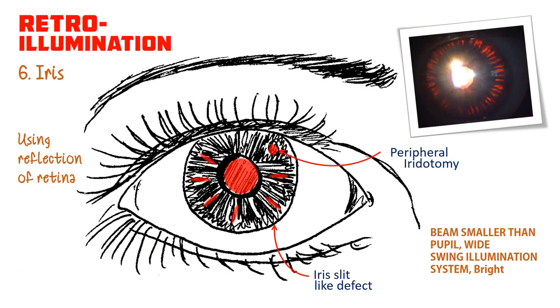The iris will be the next structure we examine. The surface can be looked at with the parallelepiped technique, but retroillumination tends to be the most useful here because you're using the red reflex to identify any defects in the iris — for example, slit-like defects from pigment dispersion syndrome or peripheral iridotomy used to help control intraocular pressure. Retroillumination is really simple and you can incorporate it into your routine exam — you'll be surprised by the amount of information it gives you.